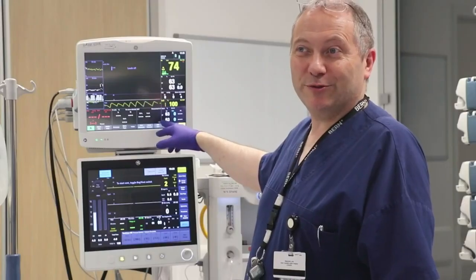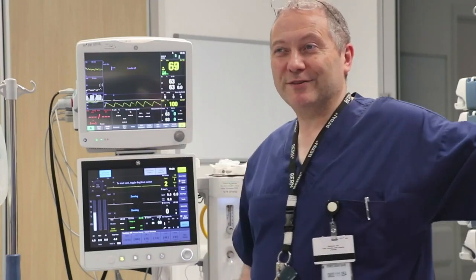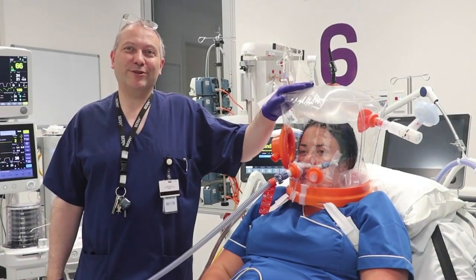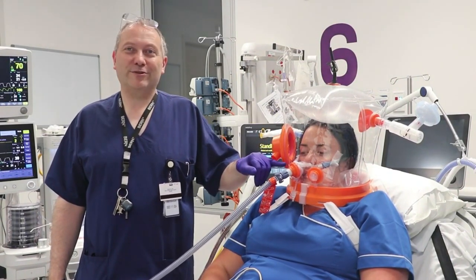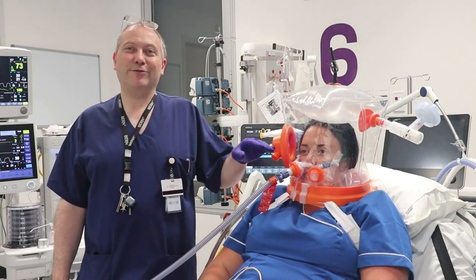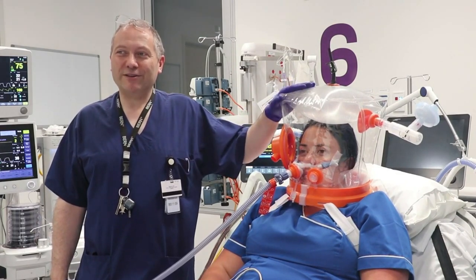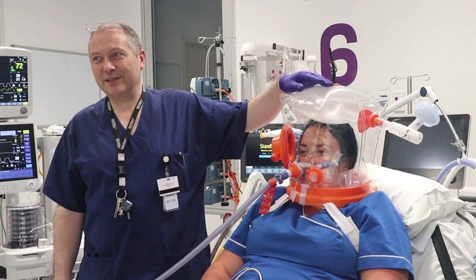That's more than double the FiO2 we achieved when we were running the same flow of oxygen directly into the helmet. Finally, what's really important to note is that we're delivering high FiO2s to Carla of warm humidified gases, ideal for maintaining ciliary function and expectoration of sputum, whilst using very conservative oxygen flows and delivering effective CPAP.